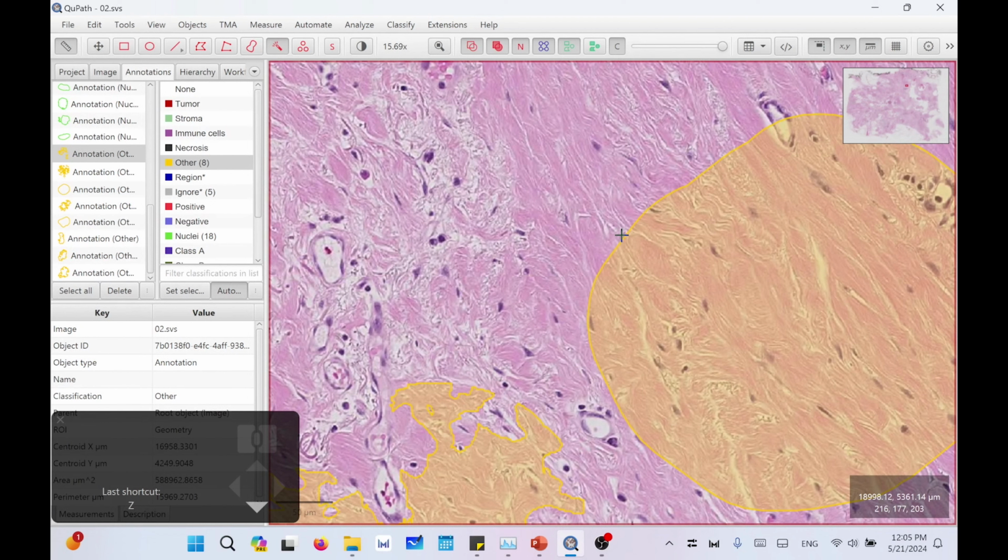The pixel classifier is not limited only to separating cytoplasm and nuclei. It can separate tumor and non-tumor. So if you are a pathologist or you know how to visually identify the difference, you can simply annotate regions with tumor and regions with non-tumor. Say there is no non-tumor class here.